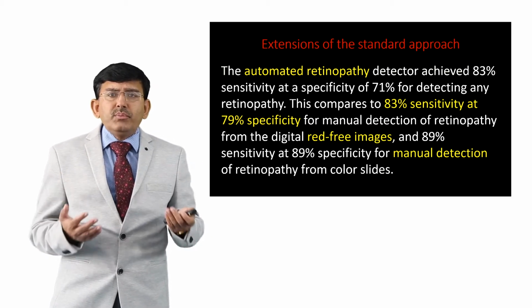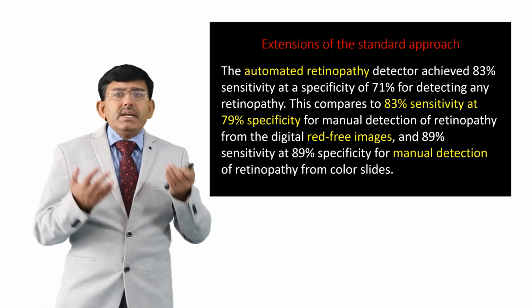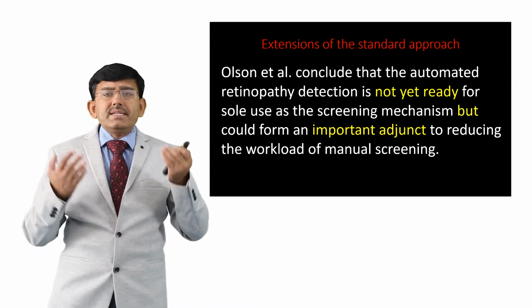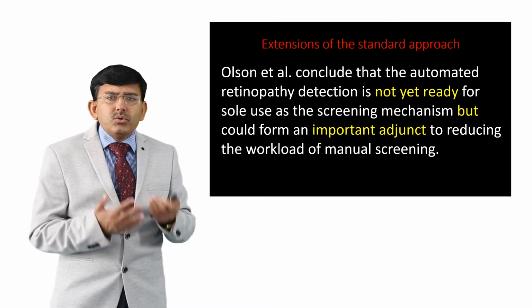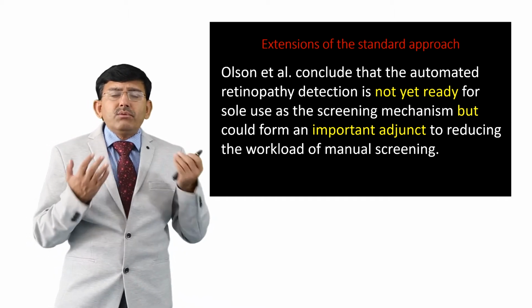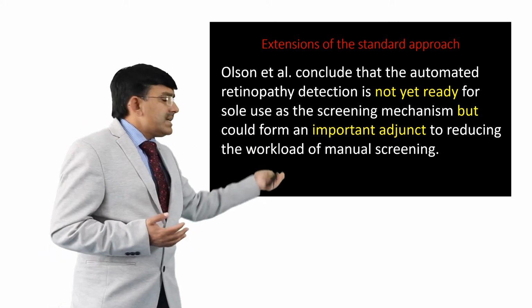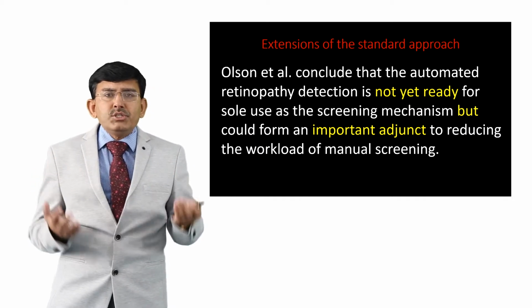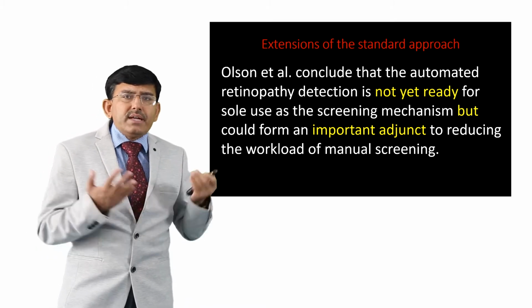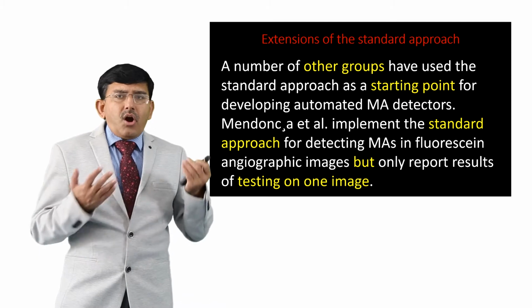Olson and his group conclude that automated retinopathy detection is not yet ready for sole use as the screening mechanism, but could form an important adjunct to reduce the workload of the manual screening process, which is tedious and time consuming.